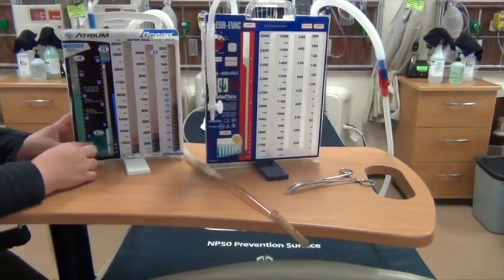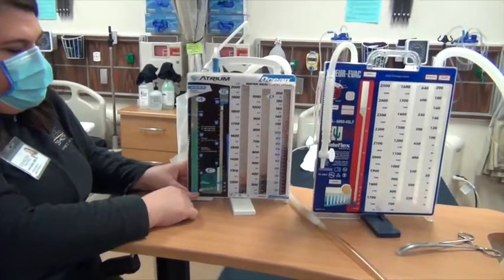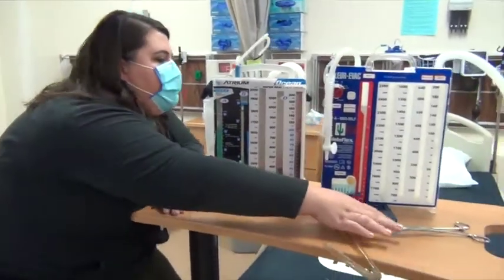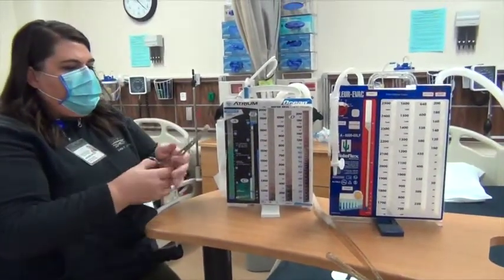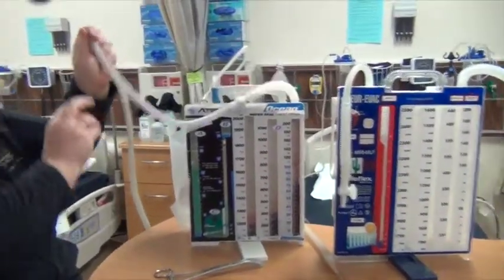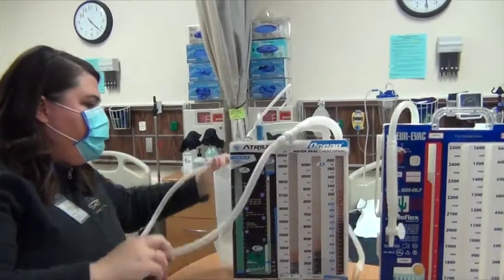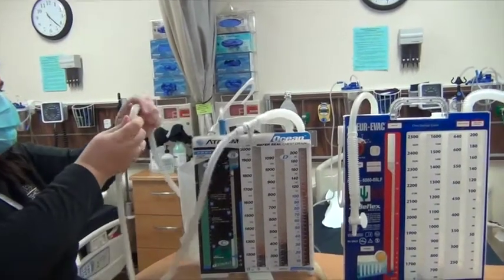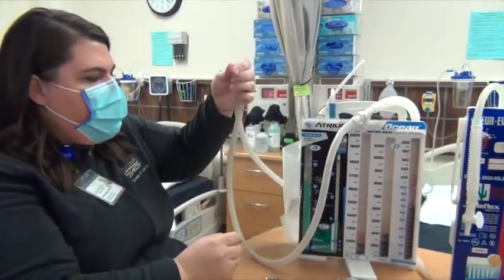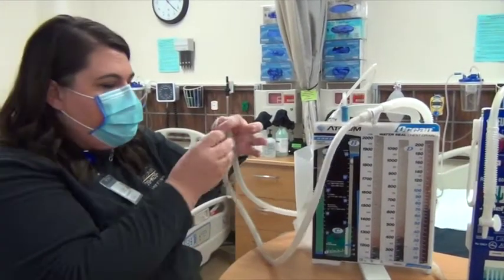So it's not so uncommon to see an air leak. You're just watching to make sure that it doesn't get any bigger. If you have a bigger air leak, then we need to troubleshoot. In order to troubleshoot an air leak, you're going to take a Kelly clamp or you can just kink it, and you're going to watch for the bubbling to stop. So if I kinked my tubing, so let's say there's an air leak in here, and I kink my tubing and the bubbling stops, that means I stopped the leak.